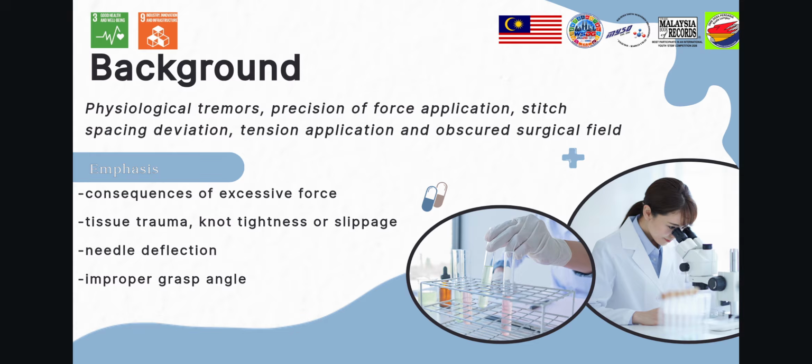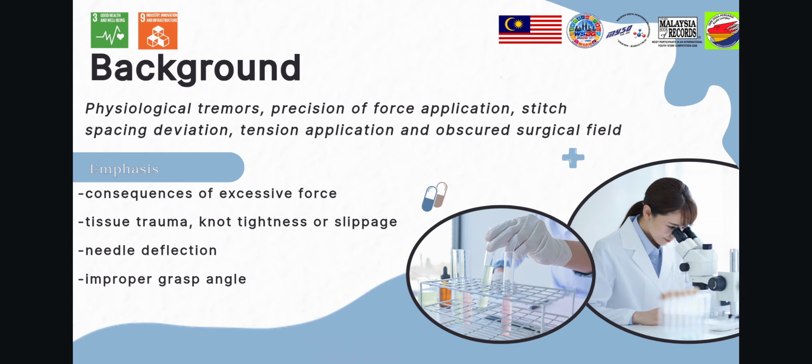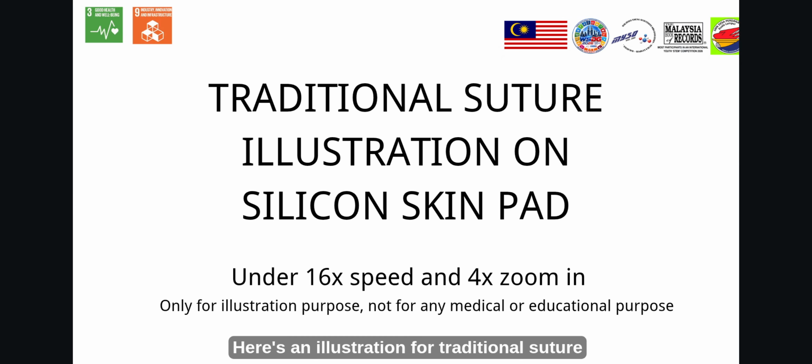Therefore, it emphasizes the consequences of excessive force, tissue trauma, knot tightness or slippage, needle deflection, and improper grasp angle caused by traditional suture.